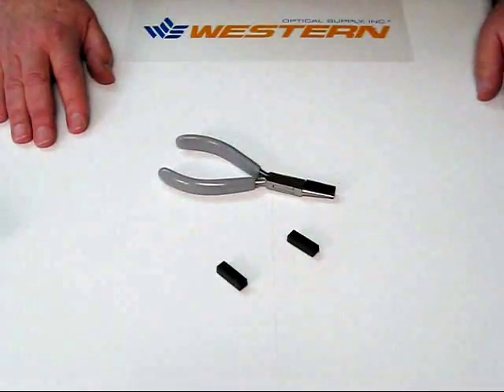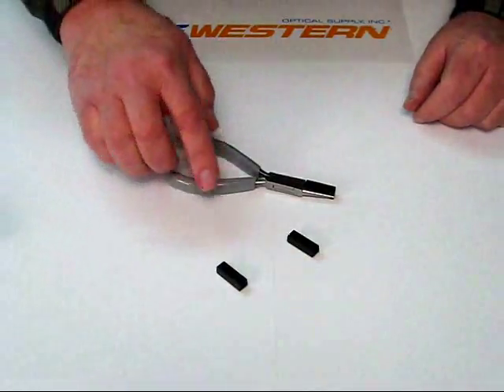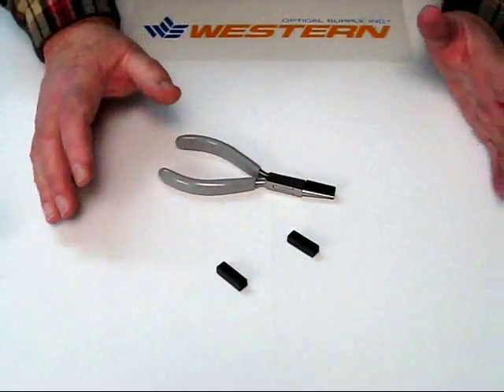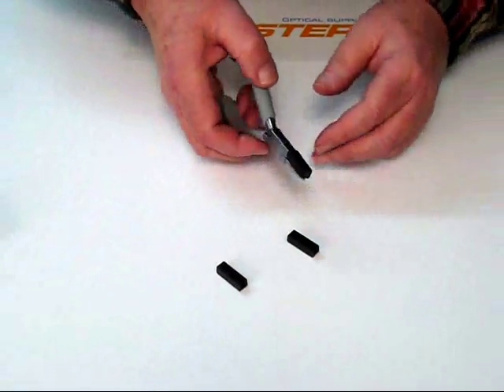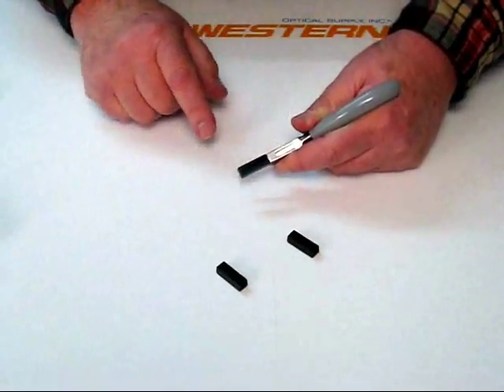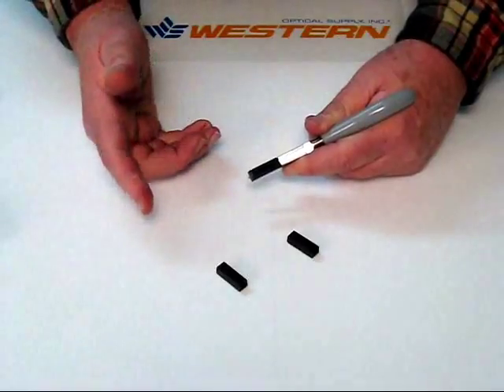Here's another really great feature that we build into our pliers, and that has to do with the pads. All our competitors mount the pads to their pliers using screws. We don't have any screws. What's the problem with screws?